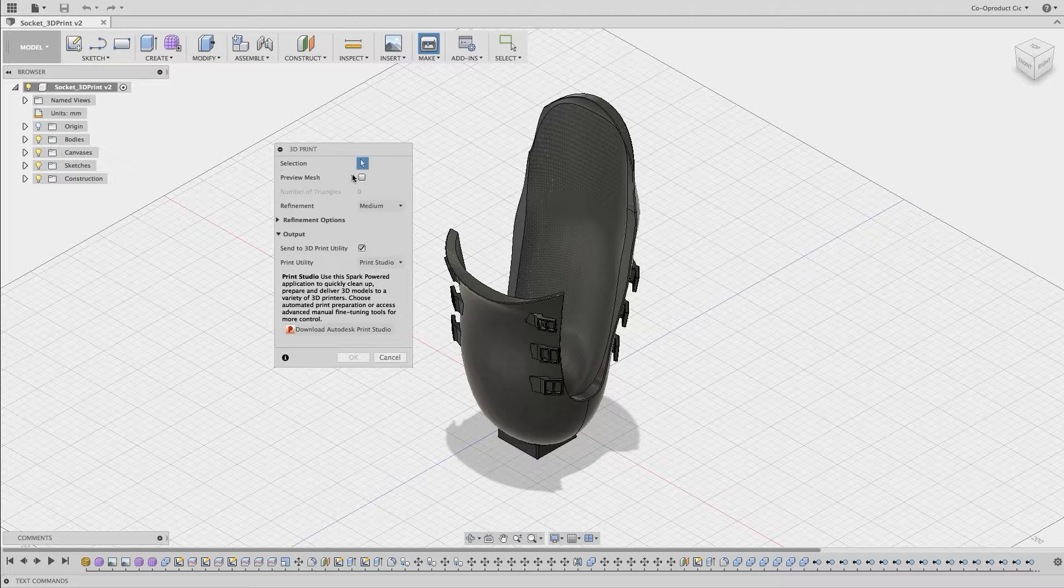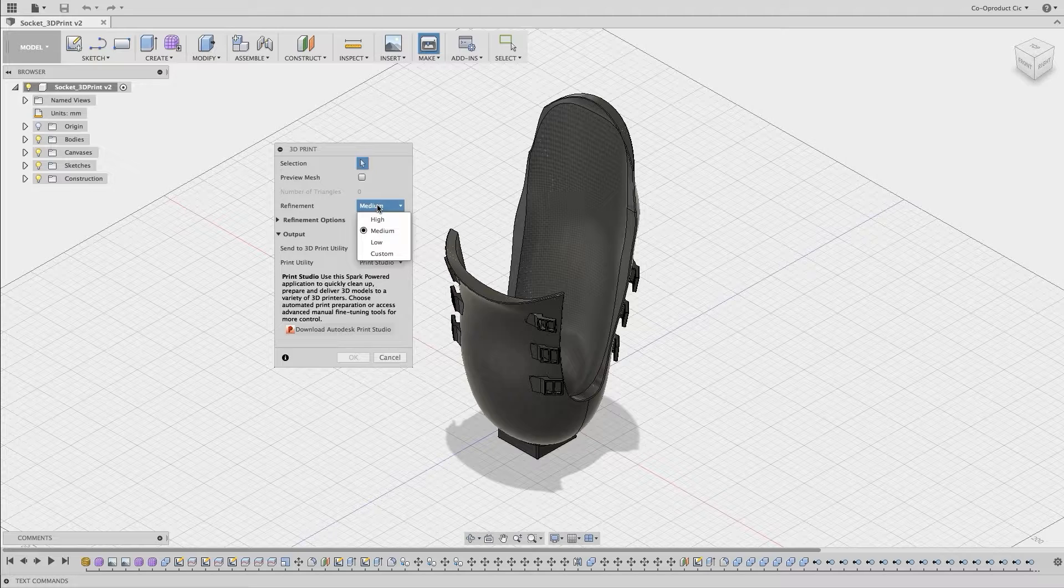In the window, we can preview the mesh if we wish, and we can set the refinement levels. There are presets for low, medium and high, and we can toggle between these.